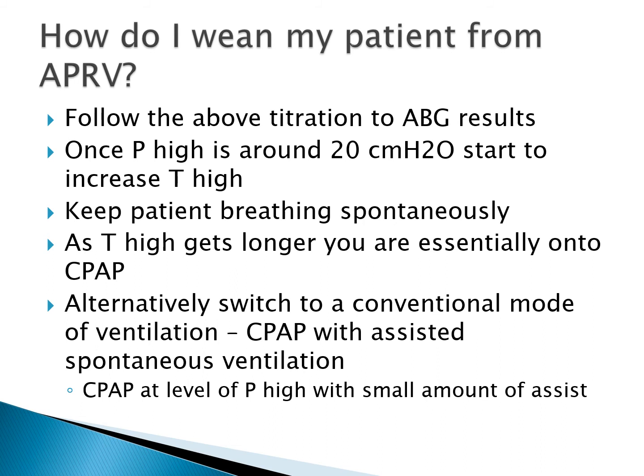At that point, if your patient's ready for a trial of extubation, that could be the time to go for it. Alternatively, you could switch to a more conventional mode of ventilation, such as CPAP with assisted spontaneous breathing. I would set CPAP to be at the level of my last P high with a small amount of assist, perhaps 5 or 6 centimeters of water assist.